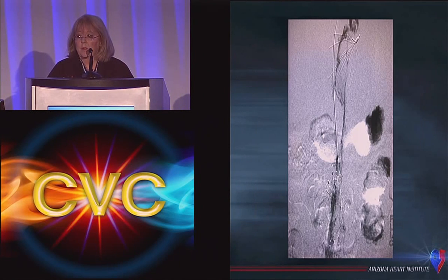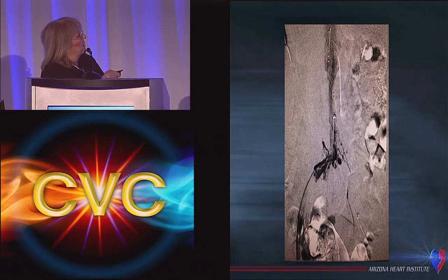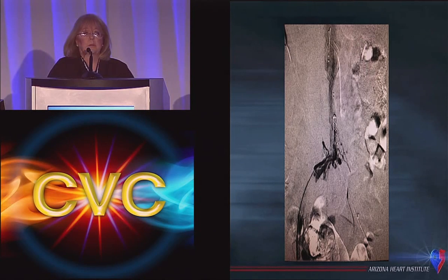So when you see an IVC filter that's occluded like this, do you put a filter above it? No. We just deal with carefully lysing the thrombus and getting rid of that, and then dealing with the chronic occlusion afterwards. Here's a patient who came from Minnesota who had a very old Greenfield filter that somebody parked rather low, so it occluded both of her iliacs. Then someone else put an Optease in a couple years ago, and she was completely occluded in both. This is a chronic occlusion. We don't put a third filter in above these patients. We just go in and reconstruct the entire cava and give her back her good flow.